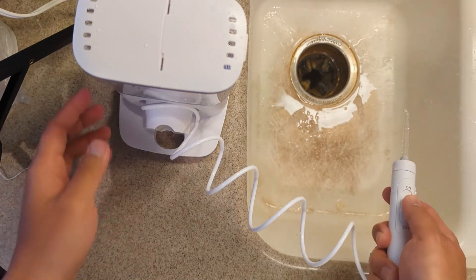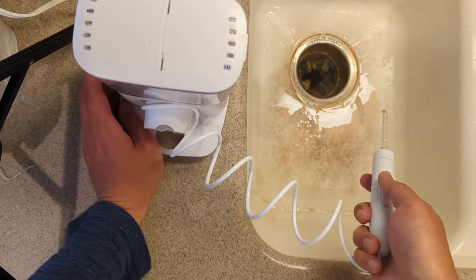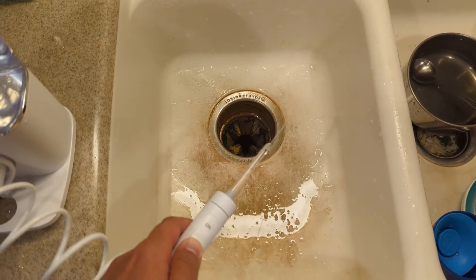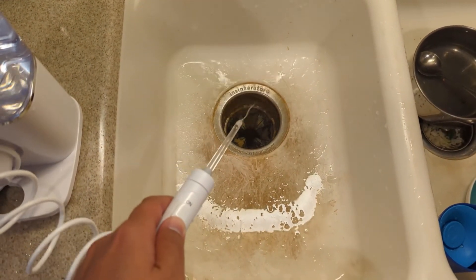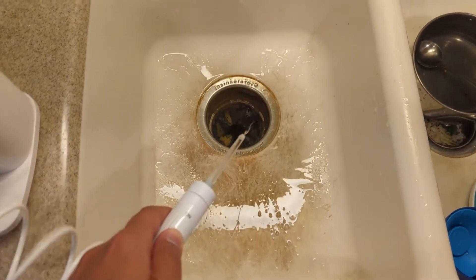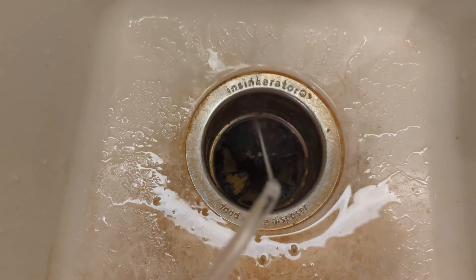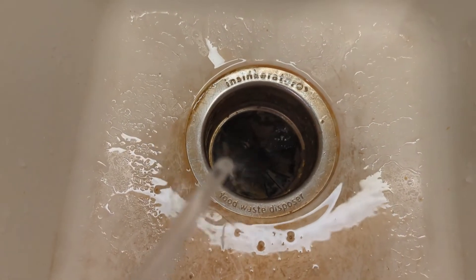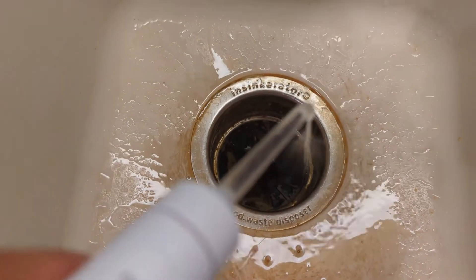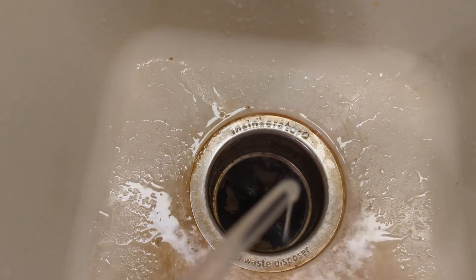Okay, number 10 — it's definitely very powerful on the teeth. So this is number 10, the strongest setting. You see it's pretty strong — you can use this to wash the sink. Definitely it works, but number 10 is way too strong on the teeth.